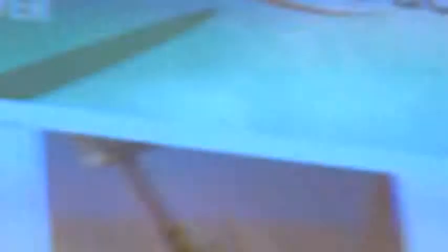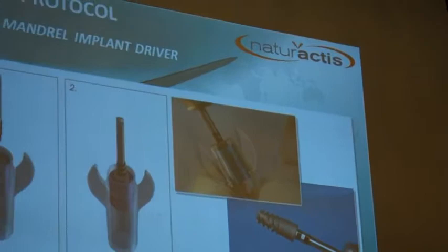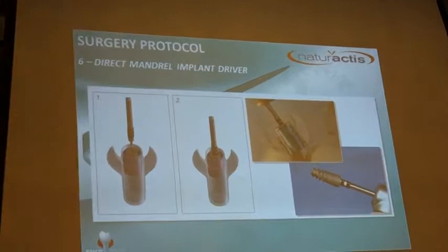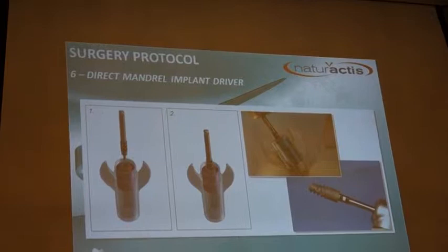To place your implant, use the mandrel with the contra-angle handpiece. You pick up the implant directly in the connection with the mandrel. You can also place it manually, but manual placement is not recommended because you cannot control the torque being applied.